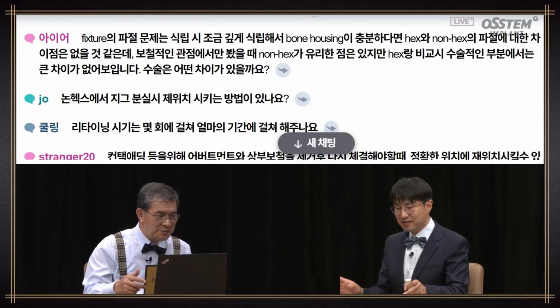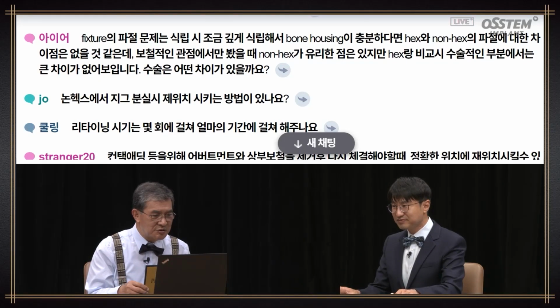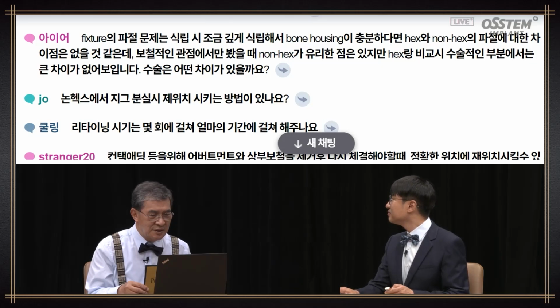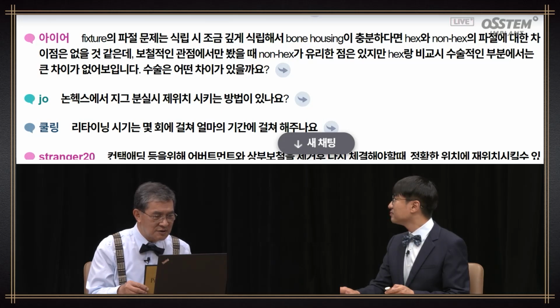Higher implant fracture risk: if you place it slightly deeply and if the bone housing is sufficient, I don't think there is a difference in terms of fracture between hex and non-hex implants. Prosthodontically, non-hex seems to have many advantages, but in terms of surgery, there seems to be little difference between the two.